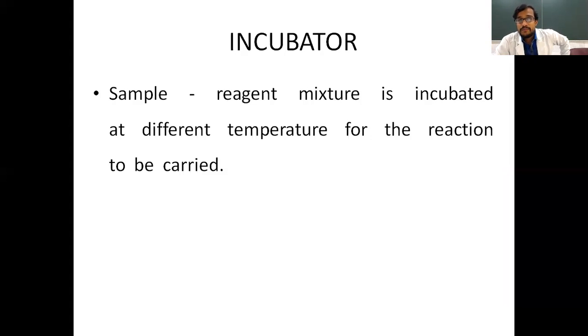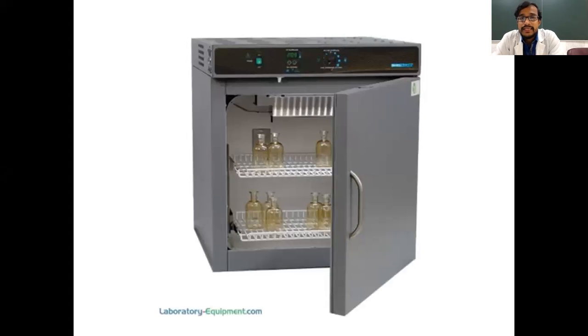Even room temperature may not be uniform in our room. So in that case also, we can keep the test tubes in the incubator so that the temperature will be maintained uniformly and the reaction will be completed easily. Okay, we know incubation is a temperature which is maintained for the reaction to be carried out comfortably. So this is the incubator you can see, and in the upper portion there is adjustment of the temperature. After adjusting the temperature, we keep the test tubes inside the incubator and close the door. We keep it for 5 minutes or 10 minutes depending upon the incubation time.